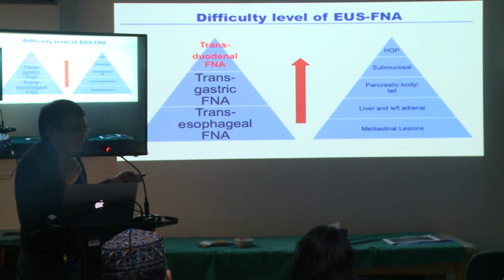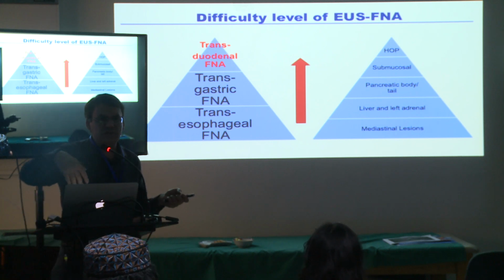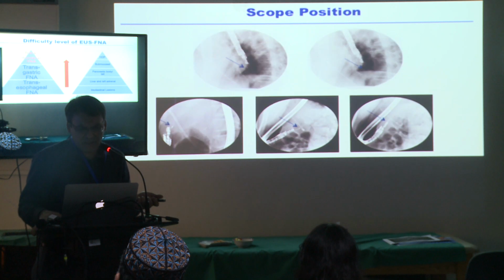Submucosal lesion, wherever it is, at times it could be difficult because usually those are mobile lesions, and getting a needle into that could be problematic sometimes.